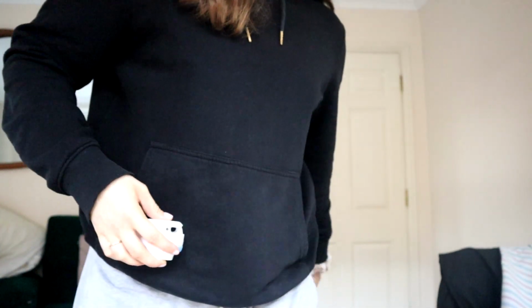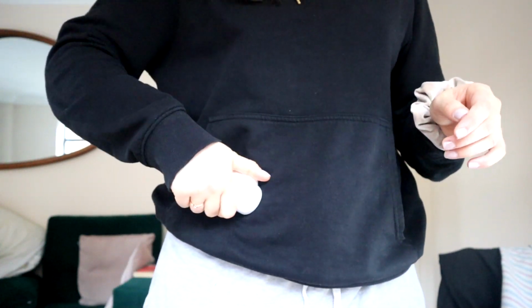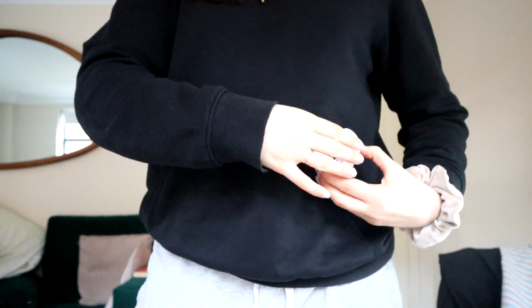So for example, if the last time I put it on I did it this way round, the next time I'll put it this way round, so the cannula is at the other end, and then I'll do that way and then that way. Within that I can move it up or down slightly and do slightly different angles. But there isn't too much room on the stomach, and it can be a bit inconvenient for certain outfits and that kind of stuff.